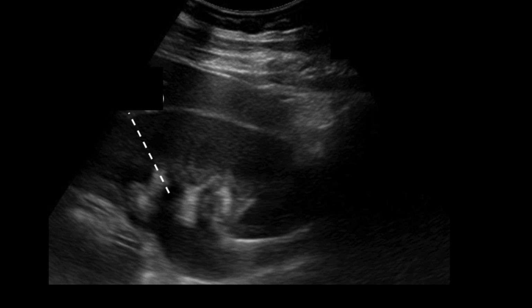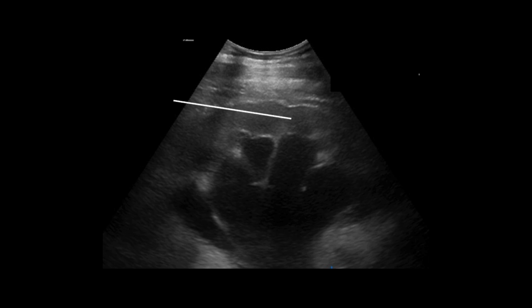Yeah. So again, hydronephrosis is quite easy to see. And the one thing is also, the cortex of the kidney there looks normal. Obviously, I know because I look at a lot of kidneys, but there's no cortical thinning. So this is going to be acute versus something like this where you can see the cortex is thin. So this has been long-standing. I can't quantify, probably 6 months to a year. So that is different. But, obviously there's a severe hydronephrosis plus there's cortical thinning, which means this is long-standing.